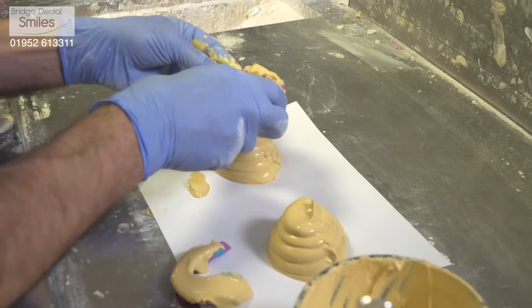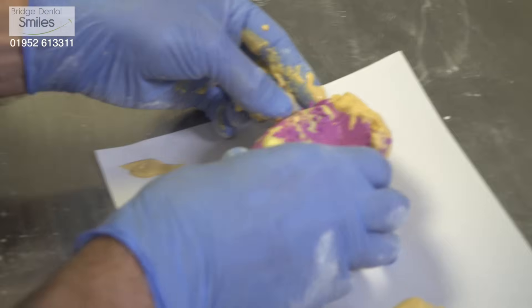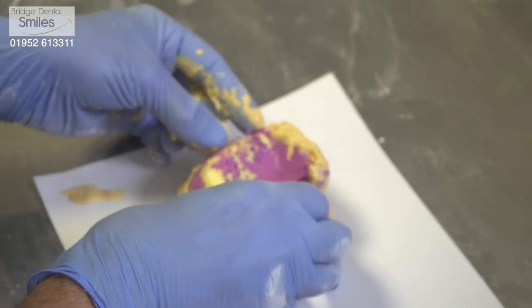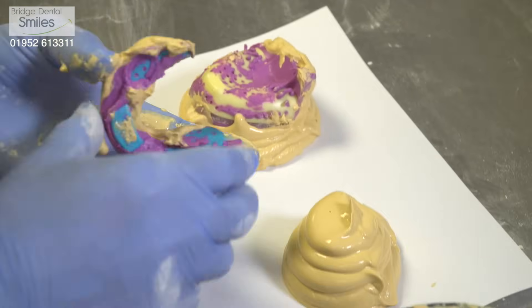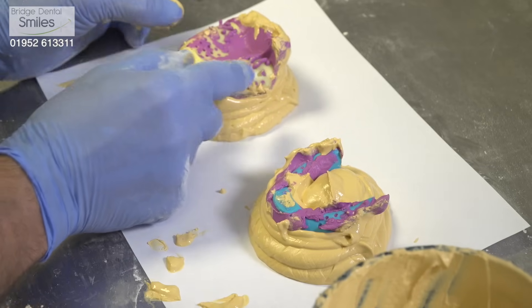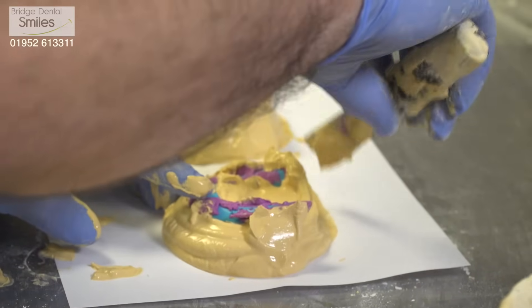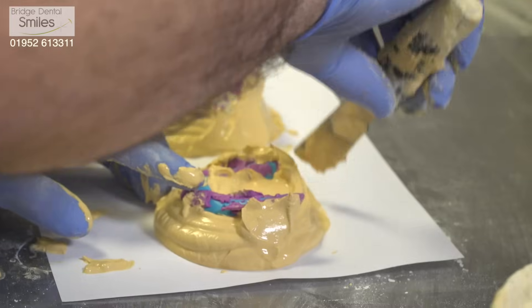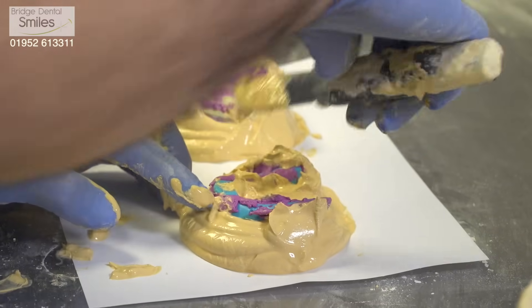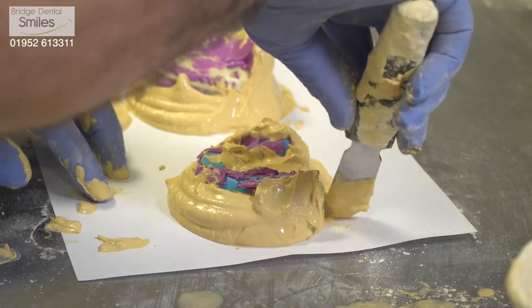What we're trying to produce here is a record of what the dentist sees, that we can then work on and do our part of the job. The first stage will be to produce a special tray and a bite rim, which we send back to the practice so they can take it forward to the next stage. This first stage is one of probably four.